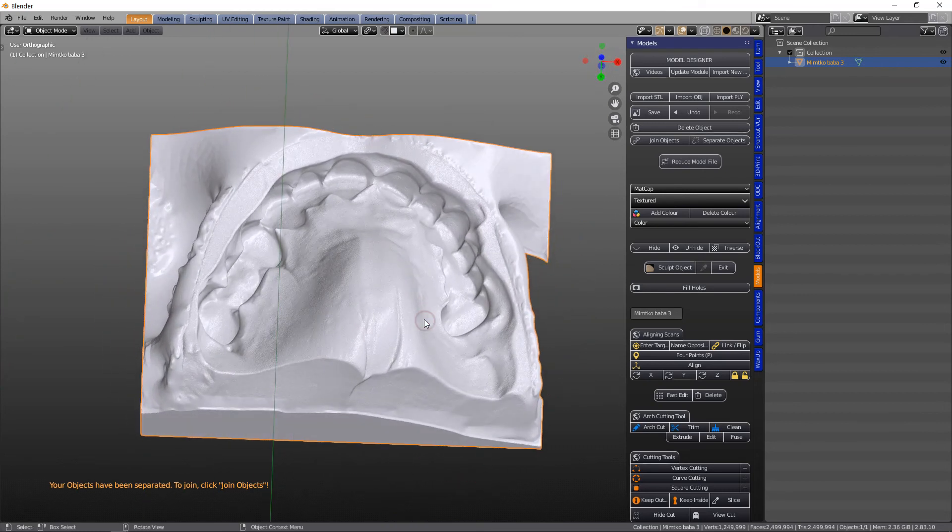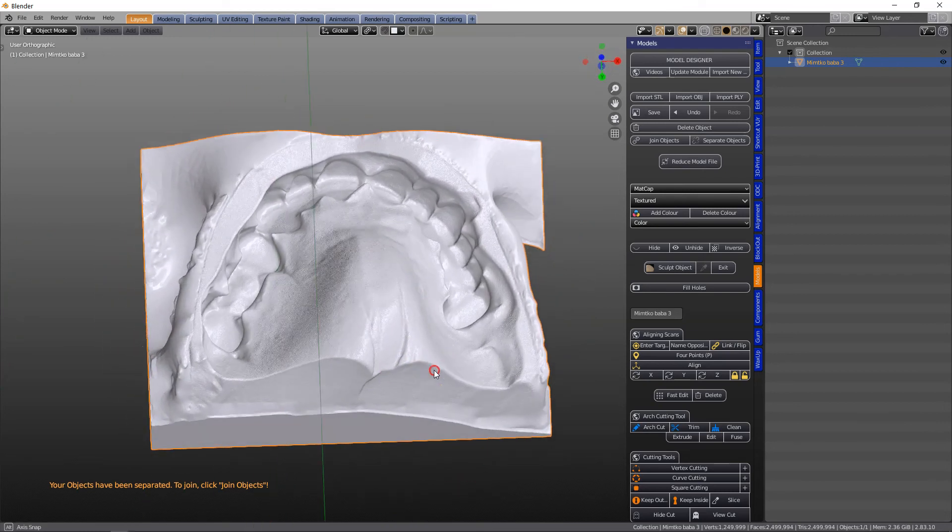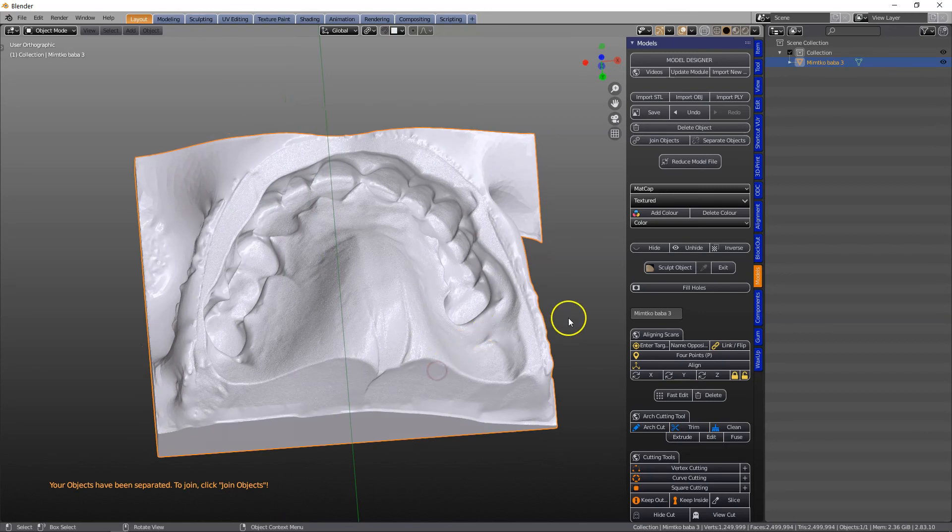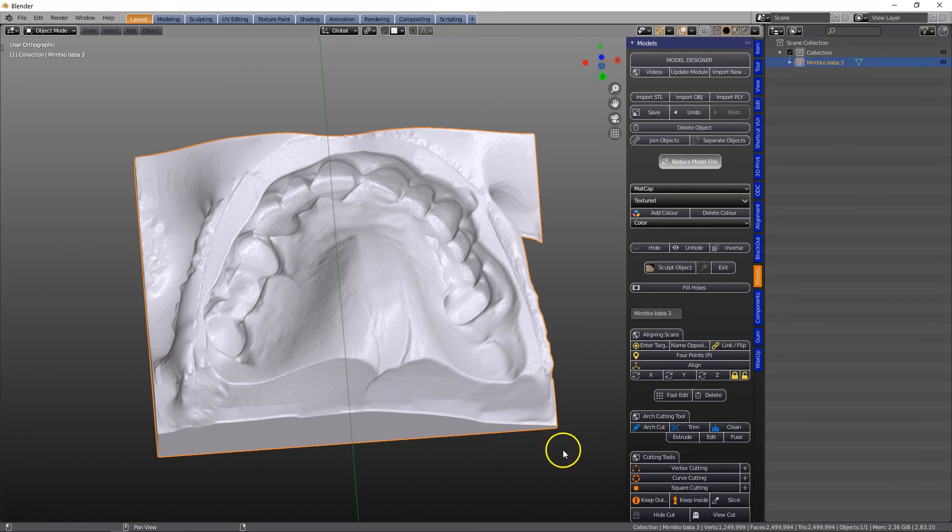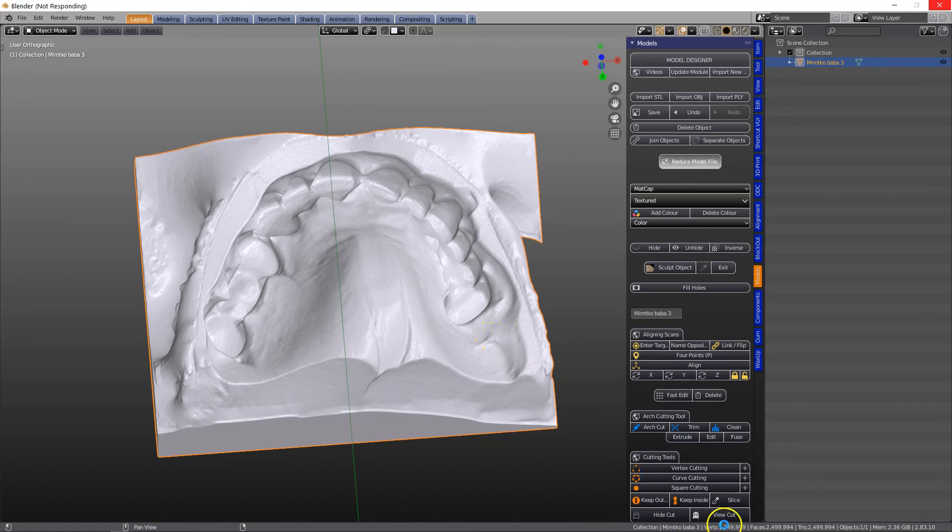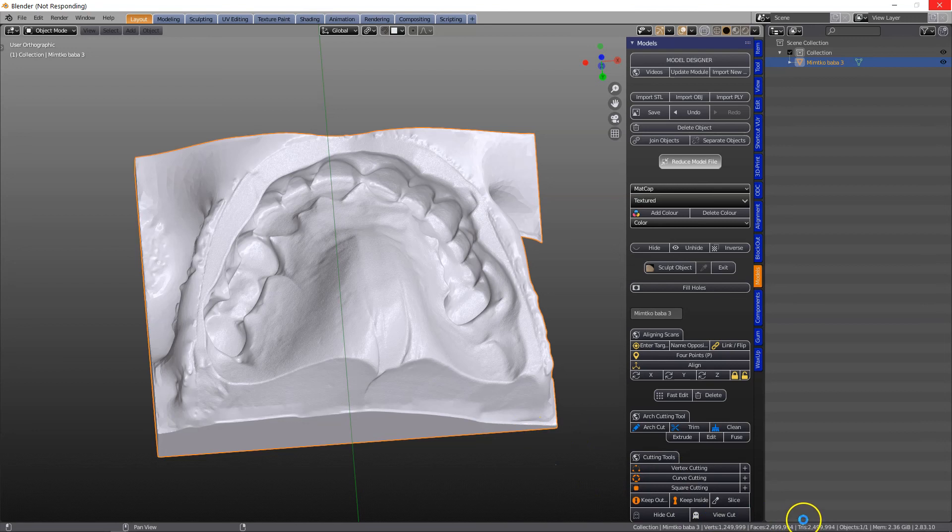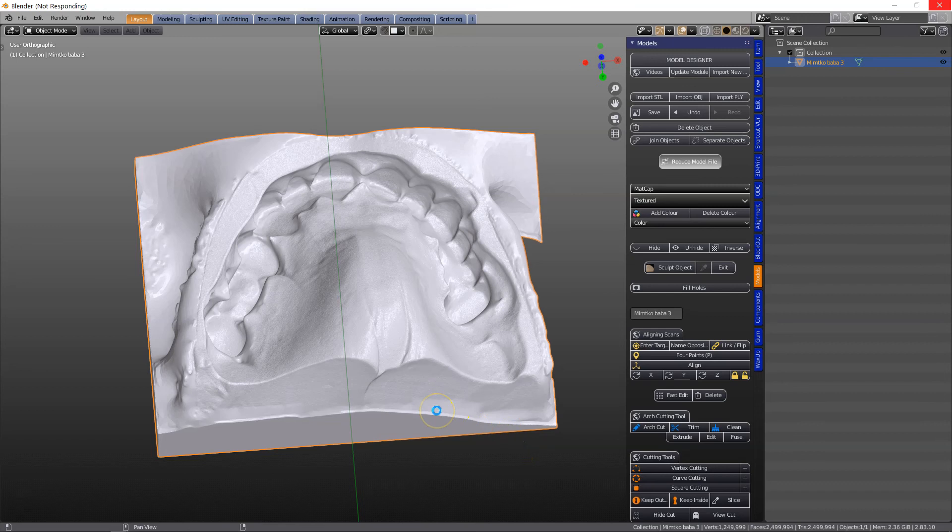But the density is too dense for my liking, so what I'm going to do is we're going to reduce the model file. As it was, it was like 2 million vertices or something, maybe a bit less, 1,300,000, but 2.5 million faces. So we can reduce this.